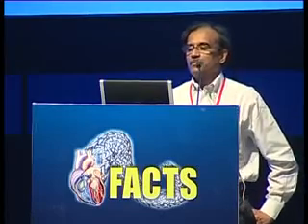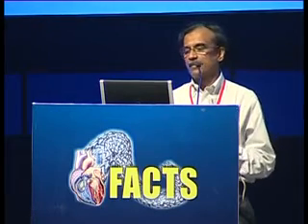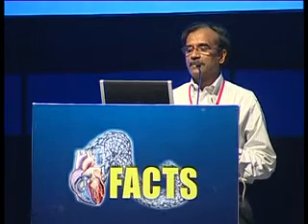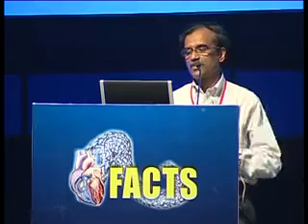Sometimes when you are manipulating this balloon mitral catheter, it can go into the pulmonary vein, and this can be recognized by the lack of free motion of the distal catheter when attempting to advance, or twist or untwist the catheter.